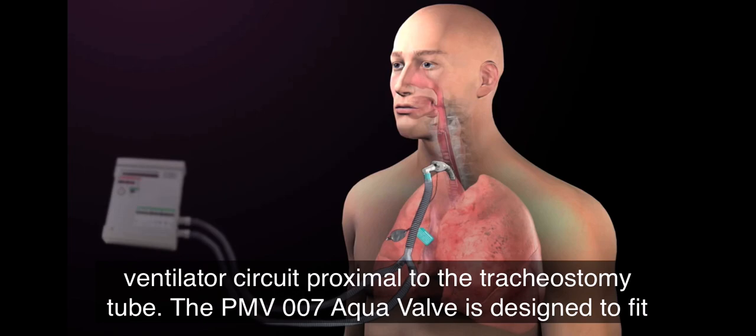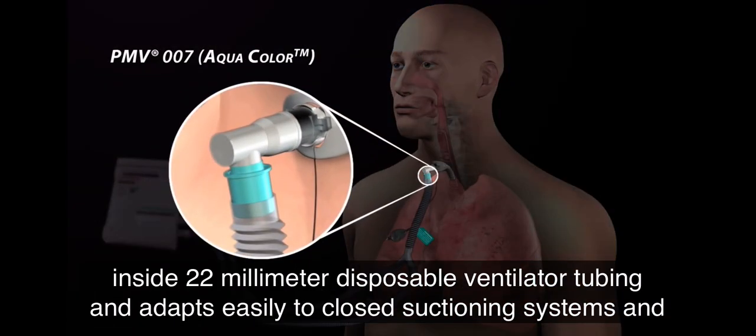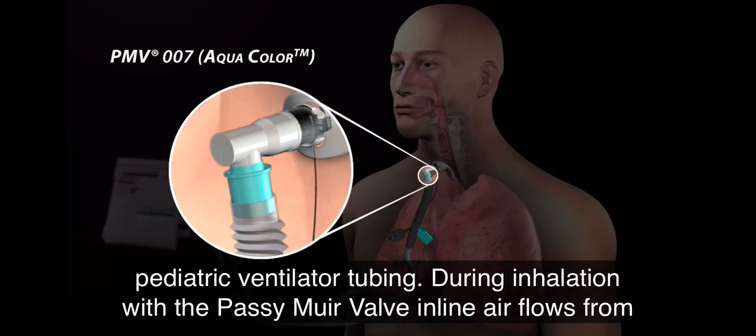The PMV-007 aqua valve is designed to fit inside 22 mm disposable ventilator tubing and adapts easily to closed suctioning systems and pediatric ventilator tubing.